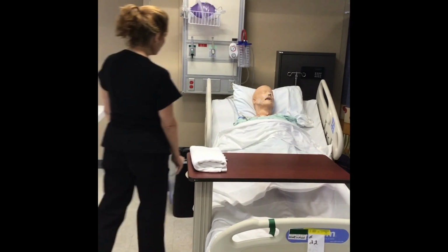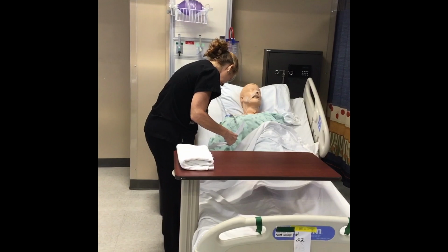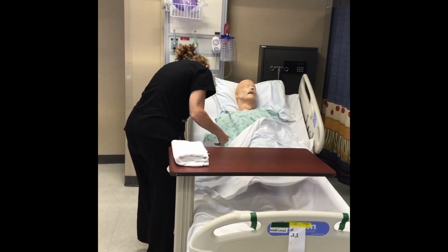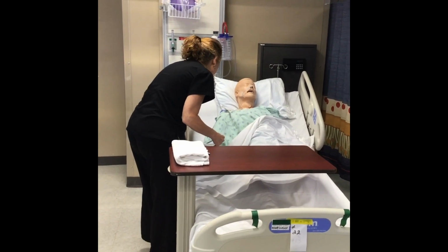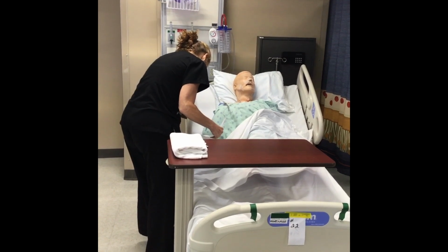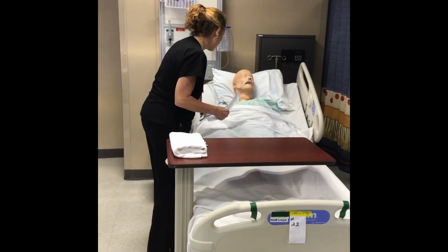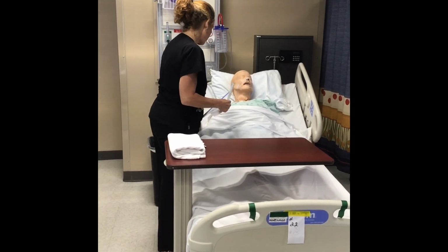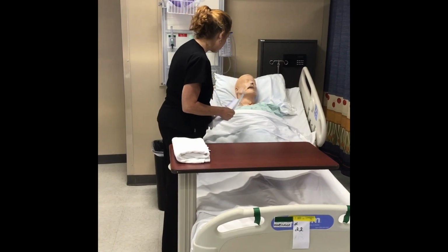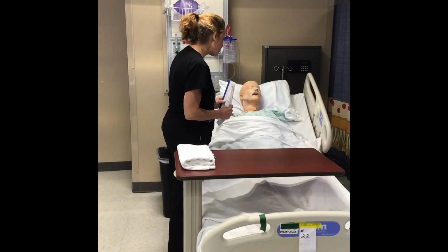My name is Tina Mathers, and I'm going to be your student nurse today. Can I get your name and date of birth, please? Yes, my name is Shirley Gibbons, and my birthday is May 5th, 1964. And what are your drug allergies, please? I'm allergic to codeine and sulfa, and also I'm allergic to latex. Okay, none of the procedures that your physician has ordered for you today is going to be contraindicated for those allergies. Your physician has ordered this NG tube to be removed today.